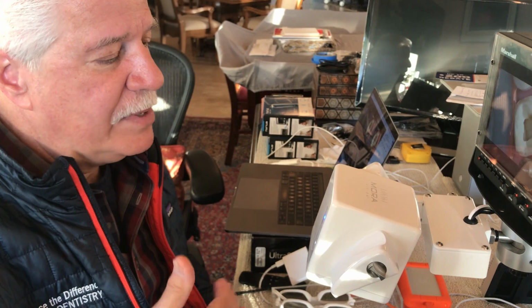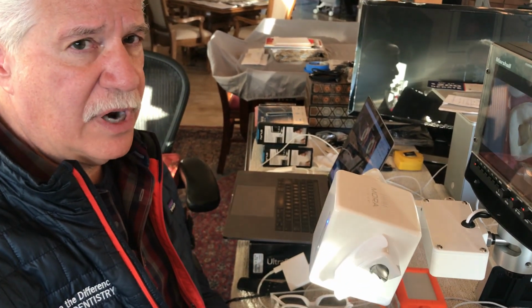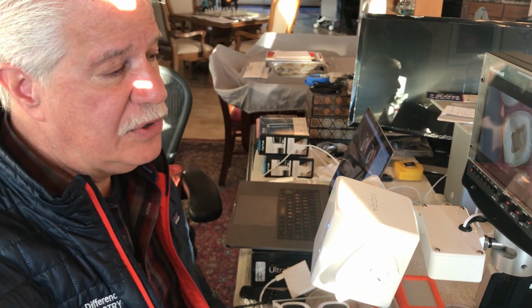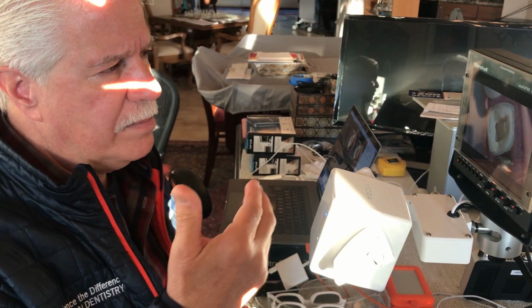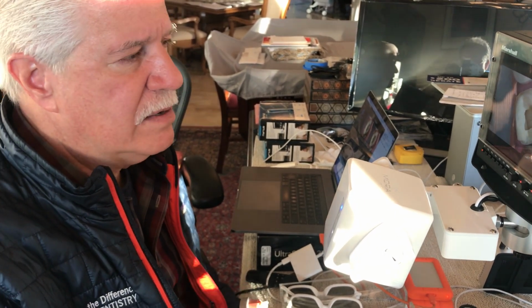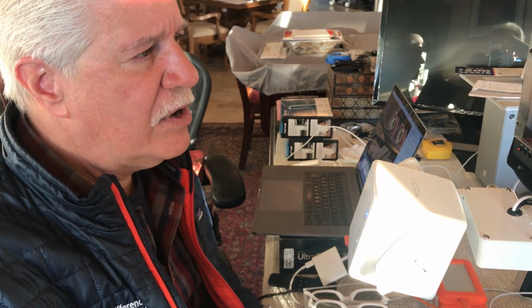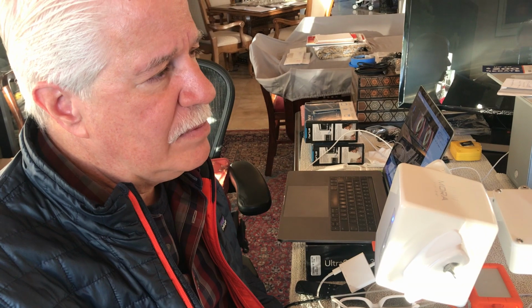Absolutely. And you'd be able to take your digital microscope, move it to positioning, and still have good ergonomics as the operator. That one feature alone is huge. And of course, the other advantage is the ability to work with the magnified image without having to learn the stereotactic control of working on a microscope. The hard part of getting our dental hygienists and even our dental auxiliaries to be competent on a microscope is they're not using it every single day, day in and day out.